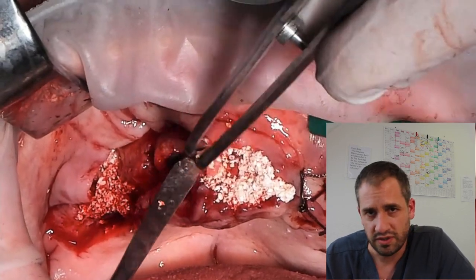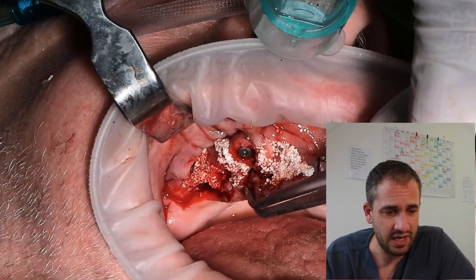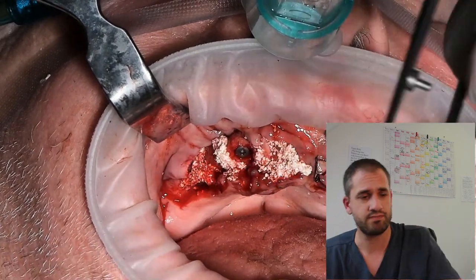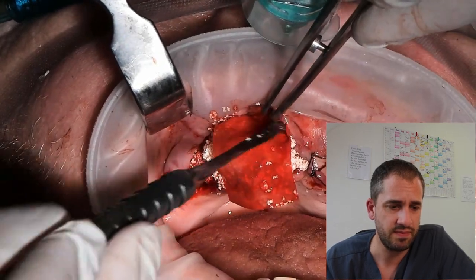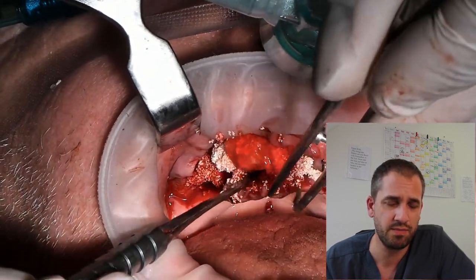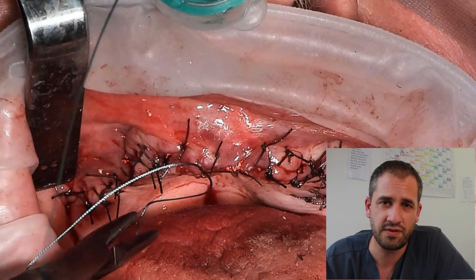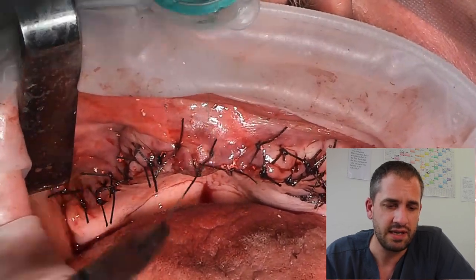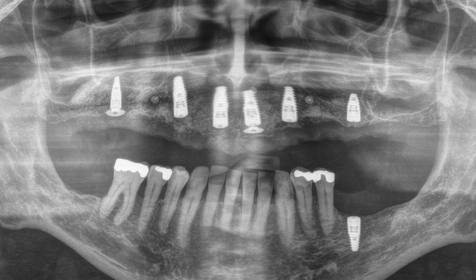I placed some other implants on the left side as well — it's always the same procedure. You fill up everything and get a smooth surface. Then we need some big membranes; in this surgery it's the Yason membrane by Botiss. Then I make some subperiosteal resorbable sutures for the fixation of the membrane, and then comes the final suturing. This is the x-ray before surgery, and here you can see two and a half to three hours later: sinus lifting on both sides using allograft rings and implants with bone rings in the front.